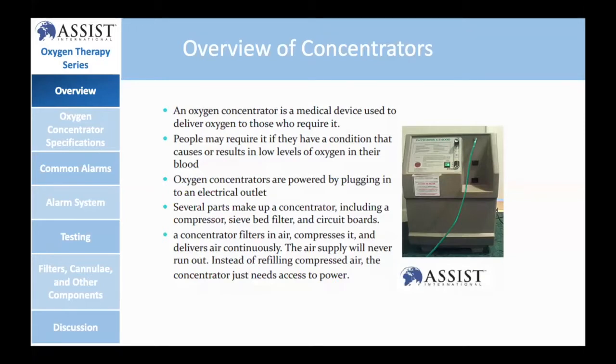Before we begin today, I just want to clarify what we're going to be presenting on. We recognize that as a part of oxygen therapy, there are multiple devices and medical technology involved. We've got ventilators and CPAP machines, oxygen concentrators, oxygen cylinders and pulse oximeters, and other devices that are critical to making sure that a patient receives oxygen.